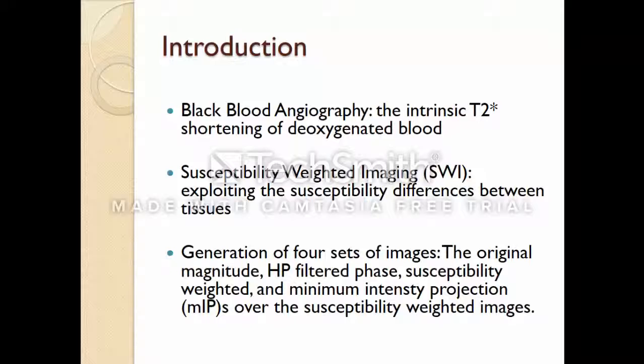So susceptibility weighted imaging is actually a new type of contrast in MR imaging. It is quite different from spin density, T1 or T2 imaging. SWI uses a fully velocity compensated three-dimensional RF spoiled high-resolution 3D gradient echo scan. This method exploits the susceptibility differences between neighboring tissues. To manifest this contrast, the signal detects substances with different susceptibilities than the neighboring tissues, such as venous blood, hemorrhage, or iron storage.